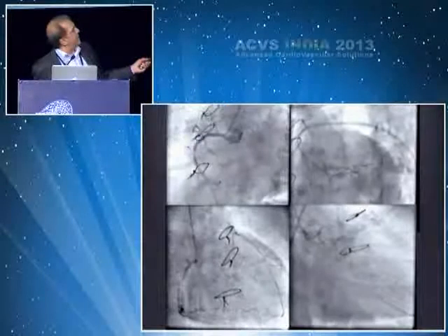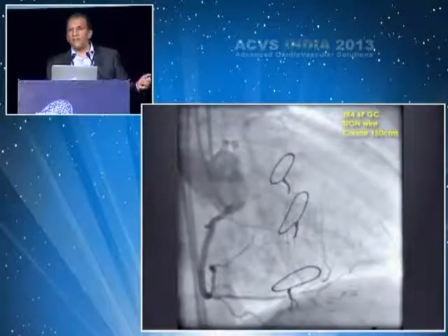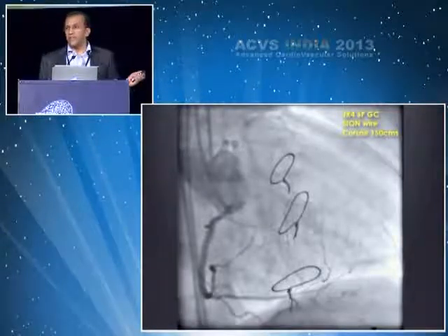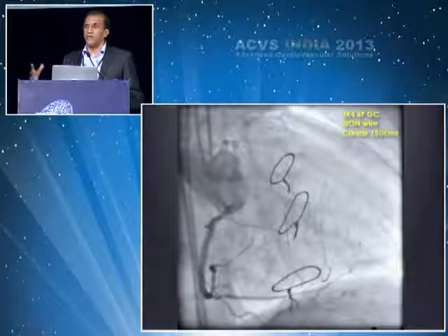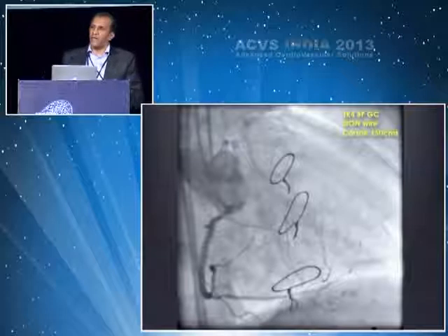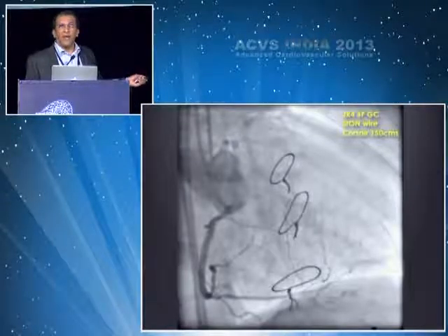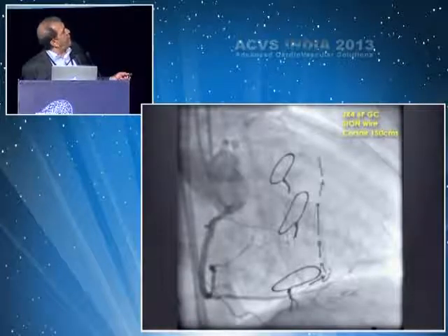And to plan this angioplasty, to set it up, it was important that we go ahead and fix the right coronary artery first. So we fixed the right coronary artery, and this was IVUS guided. We realized that the previous stents were underexpanded or undersized, so we moved up almost 0.5 millimeters in size of those stents, redid this right, and 7 days later got him back for the LAD. Now, once we set this up, it was important for us to know which channel to use.